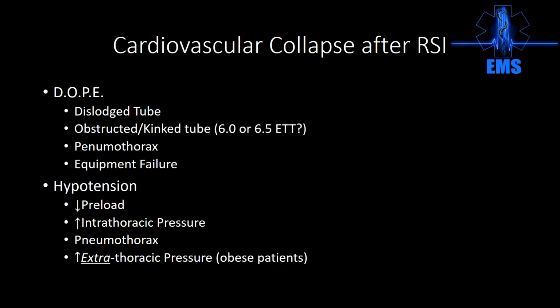The next thing you need to think about, if that's not the source, is the intrathoracic pressure. And this comes from a spontaneous pneumothorax that then causes a tension physiology. This also can come from somebody who has COPD and has air trapping. So how are you going to know this? The bag's going to be really hard to squeeze.